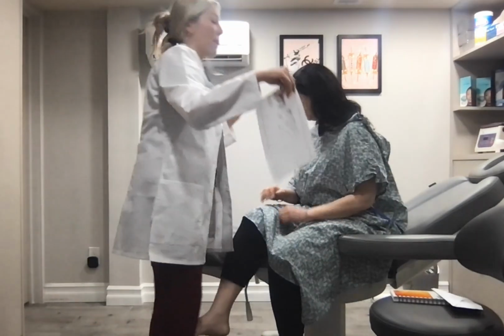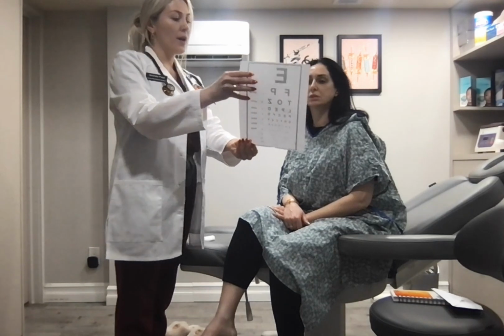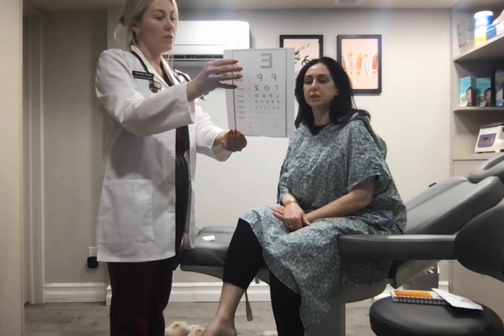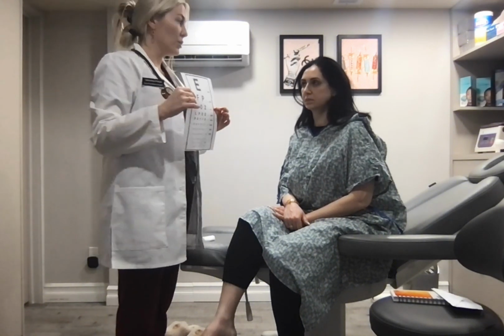Okay. We have a Snellen chart here. Okay, please read line number 8. D E F P O T E C. Okay, the test concludes that our patient has 20/20 vision.